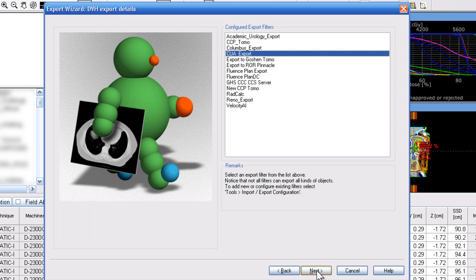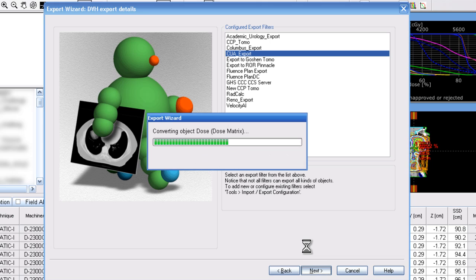You can select any DICOM media file export wizard. We have several. It doesn't really matter as long as it's the DICOM media file export.